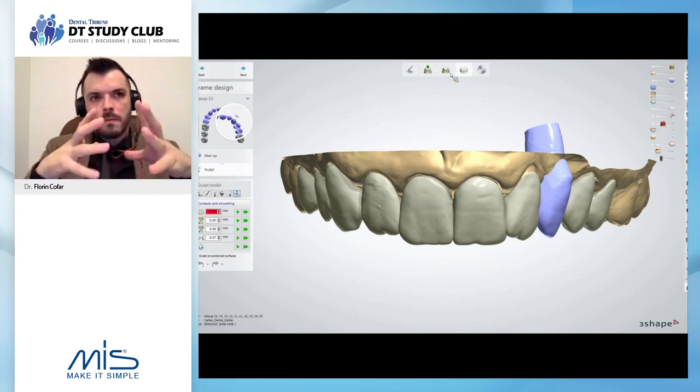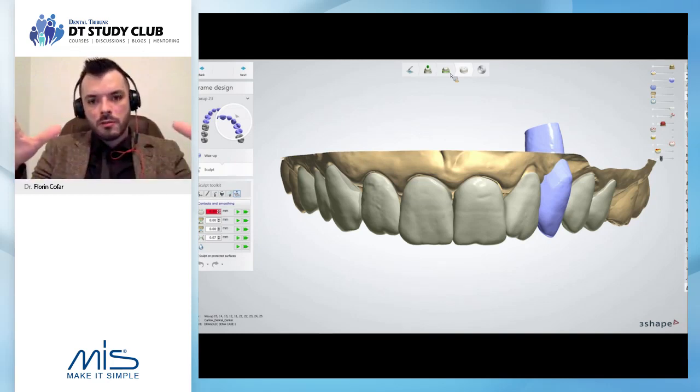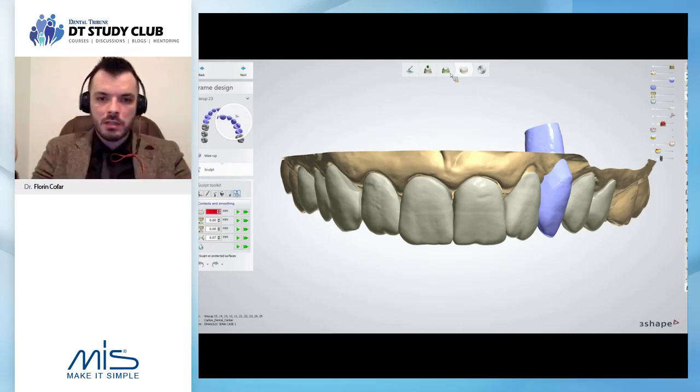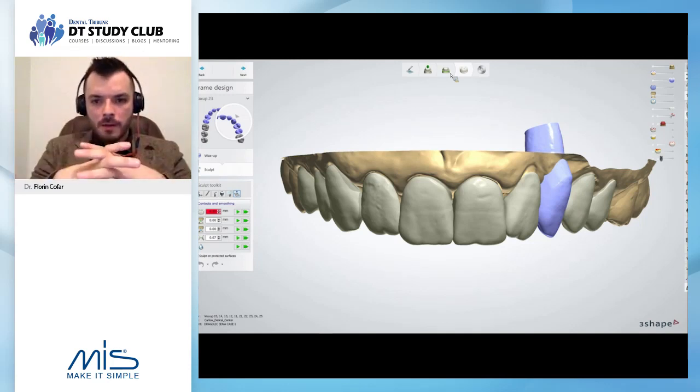Being able to control geometry through the entire workflow gives you a huge advantage. And since that final geometry is natural, this is what we want as our main concern. So we are trying to adapt all the other procedures to support this design, including the implants.